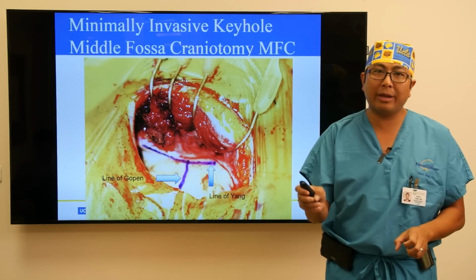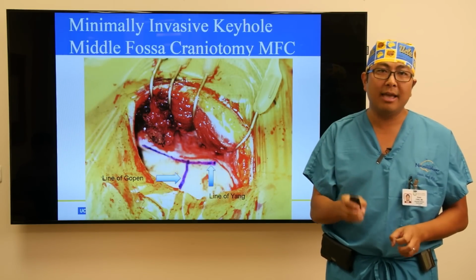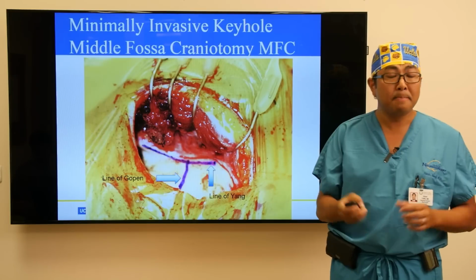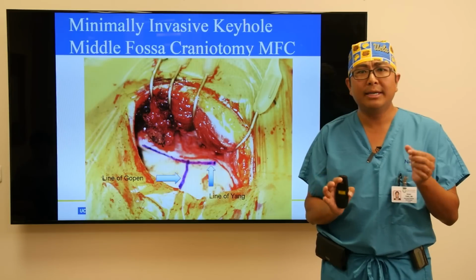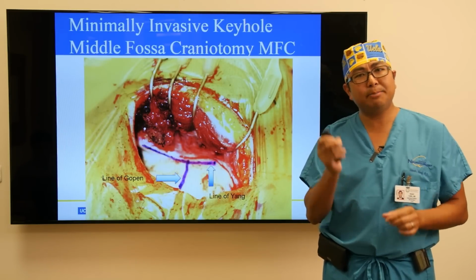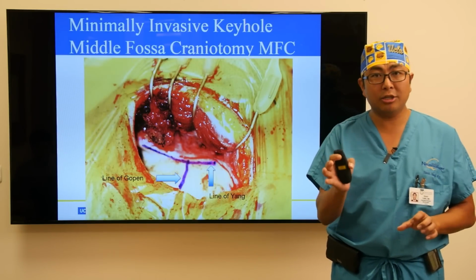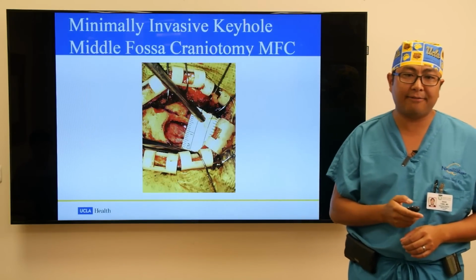And then you use the virtual reality, you use a 3D reconstruction, use the Neuro Navigation, and you're going to go from 80 to 90% down to 100%. You're going to find exactly where this tiny hole is. Because the superior semicircular canal dehiscence, this hole is about 2 millimeters. It's a super, super small hole. It's about the tip of a ballpoint pen. It's the needle in the haystack. And so experience, technology, and navigation help us to get down there quickly and effectively.